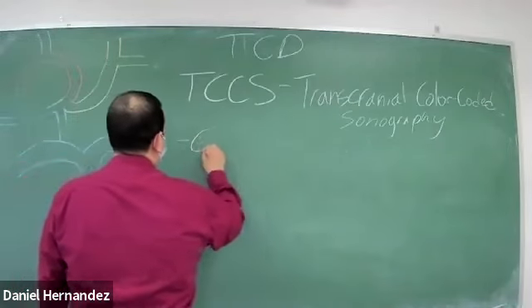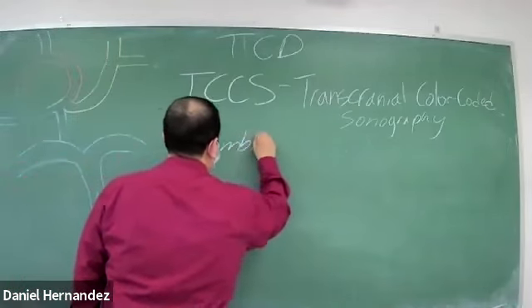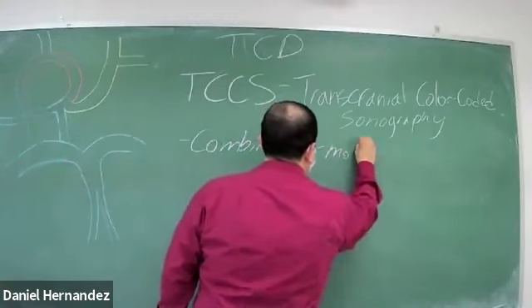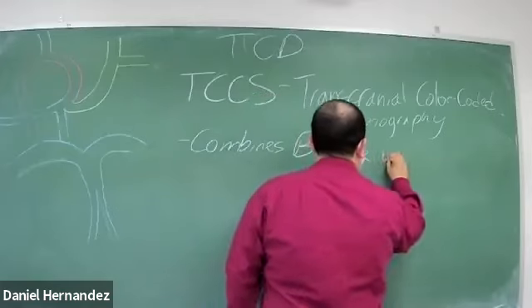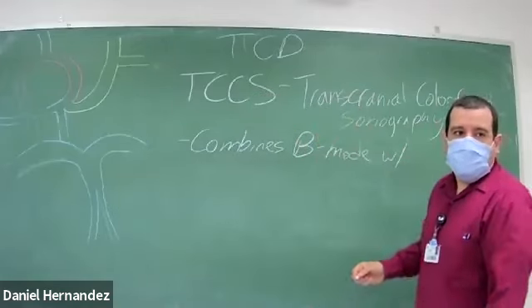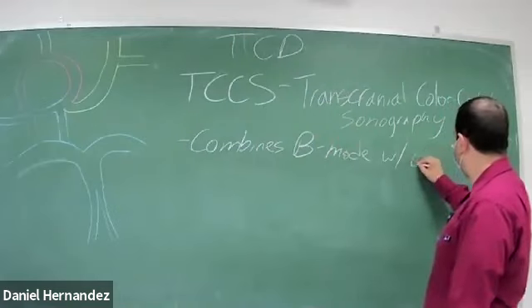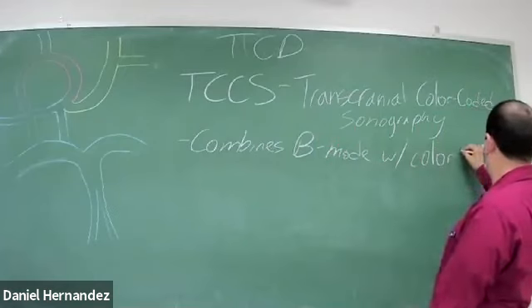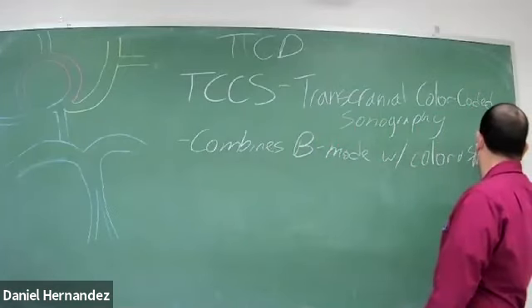This combines our B mode with color Doppler, color and spectral Doppler.